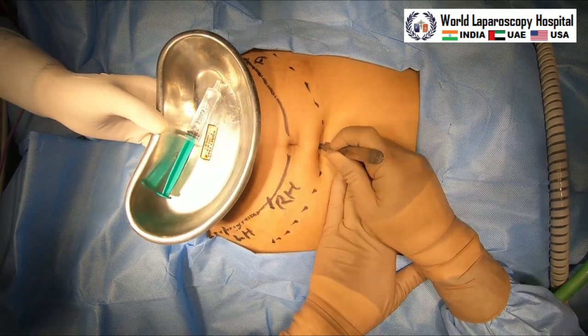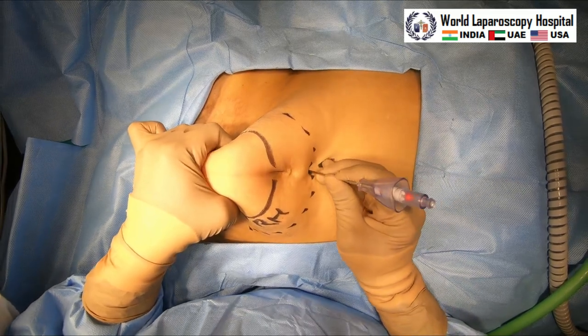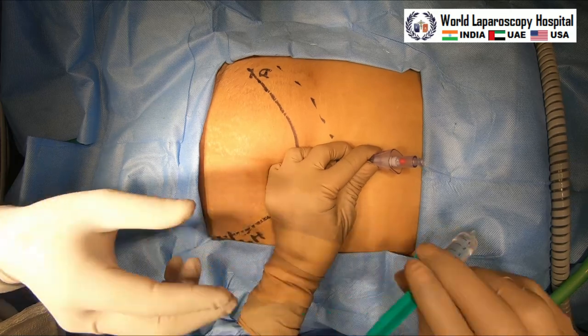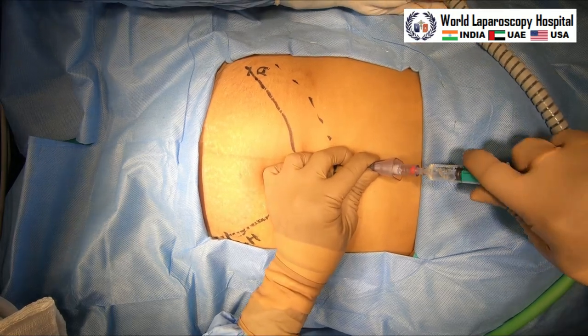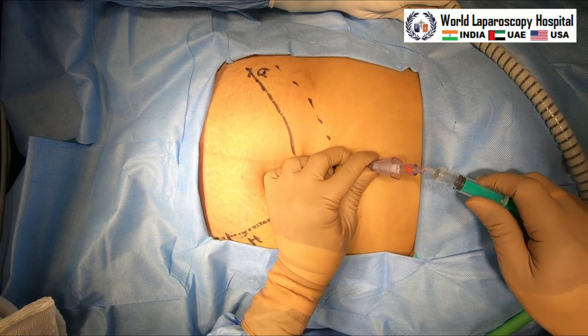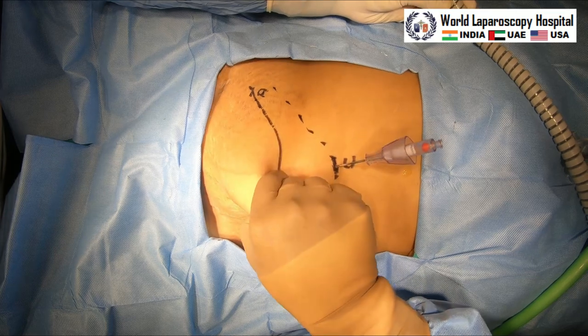And now the Veress needle will be introduced first. So two click sounds. Suction, irrigation and hanging drop test, just to confirm that the Veress needle is inside the abdomen. This is the hanging drop. It is pulled in.